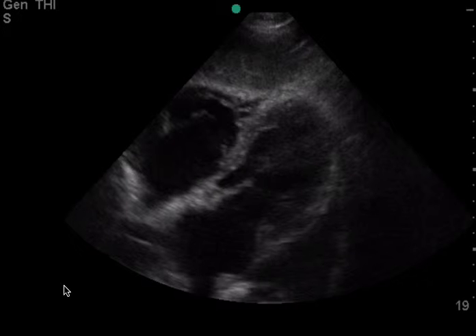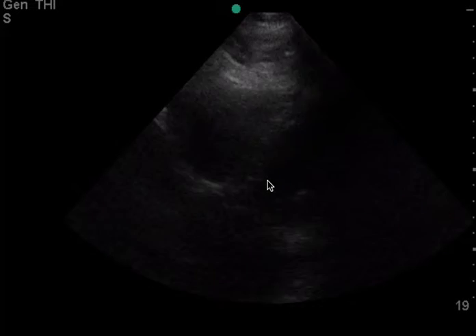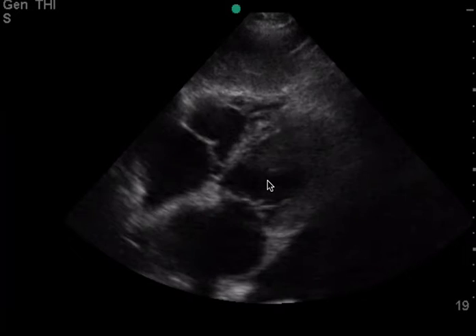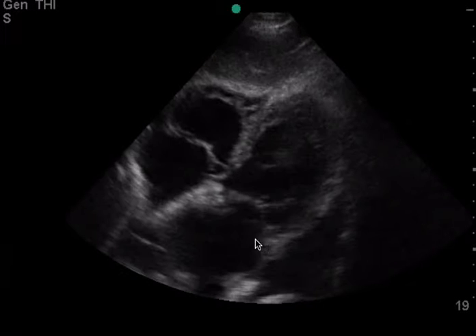This is a really interesting ultrasound of both the heart and lungs. This is a patient in acute respiratory failure. This is your subxiphoid view. You can see here on your images that you have a cardiac view here. There is no anterior effusion, but there is a pretty significant posterior effusion.